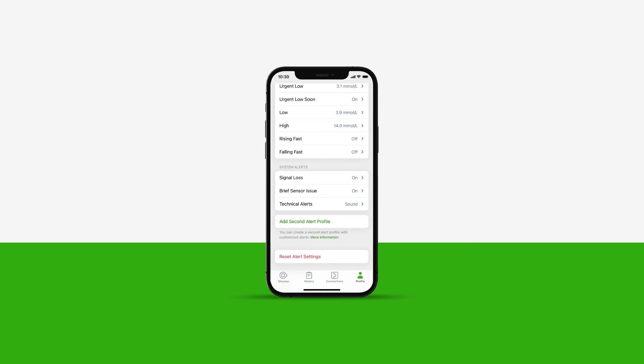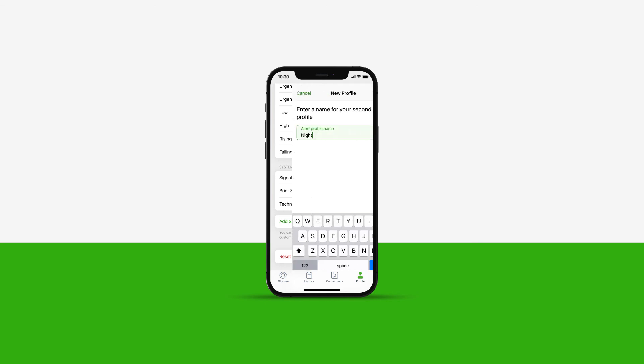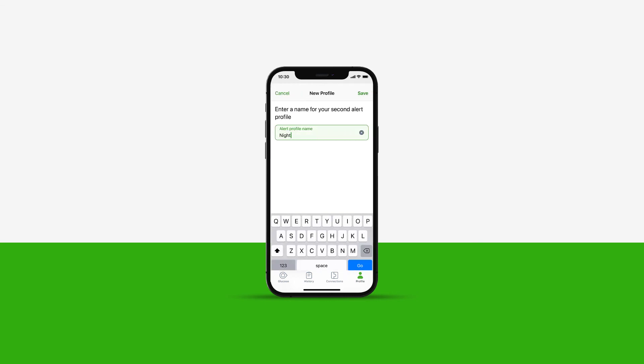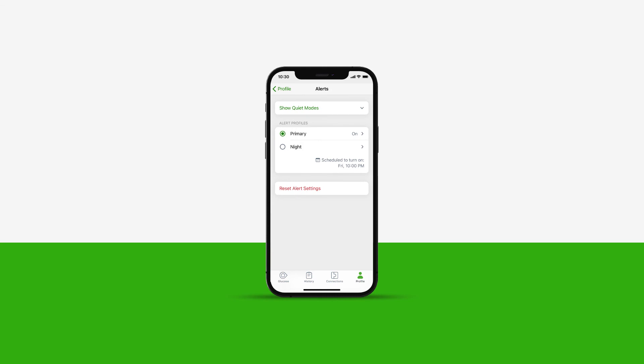If you have different requirements for your glucose alerts, you can create a second alert profile with customized alerts. For example, a night time or work profile. You can switch between or schedule profiles to certain days and time periods.